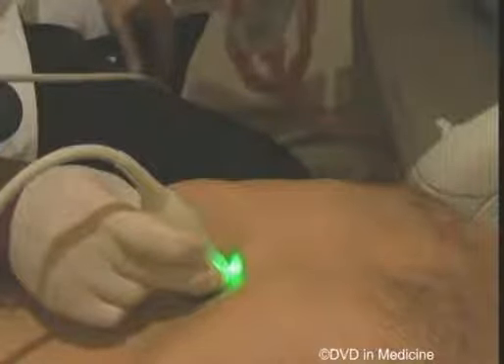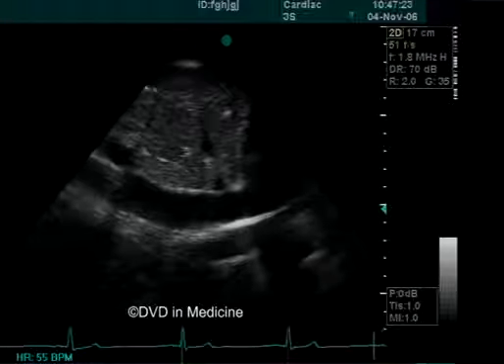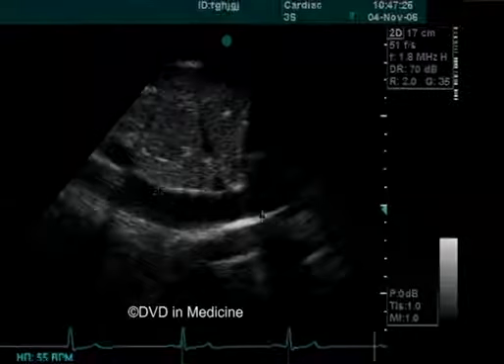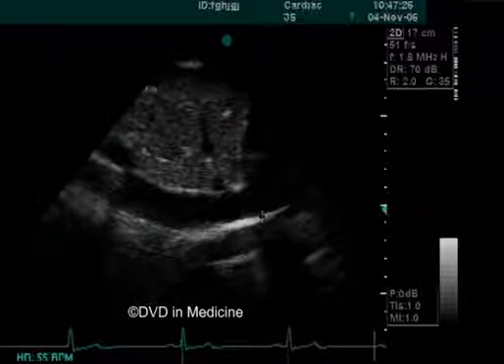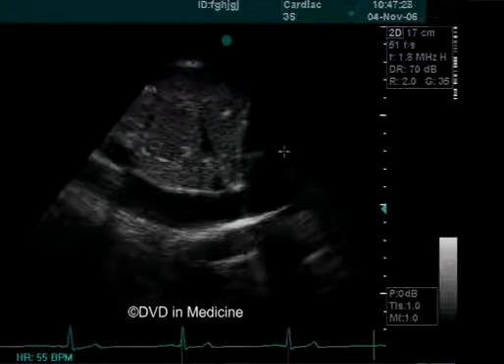One should place the transducer in the epigastric region and angle the scanning plane sagittally on the middle line and then tilt it a little to the right. Inferior vena cava is seen posteriorly to the liver. One can see the place where the inferior vena cava connects with the right atrium and sometimes with the valve at this junction.